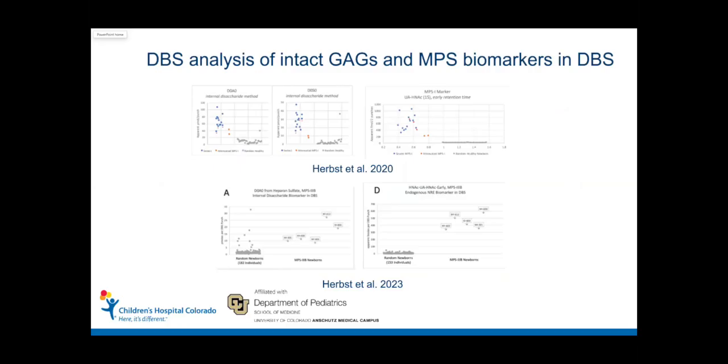And so these are two papers from Dr. Gelb's group. I think they do an amazing job just talking about the different methods. And I really think it's kudos to Dr. Gelb's group, because what they did in working with the MPS Society is they collected a whole series of dry blood spots from MPS patients as well as normal unaffected individuals. And they took the same spots and compared them across several methods.